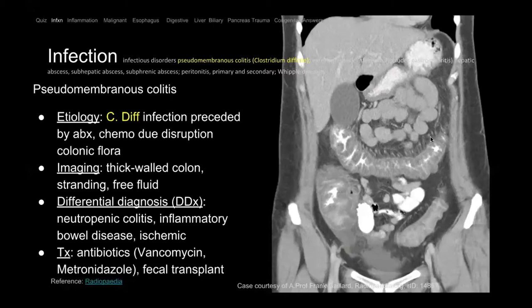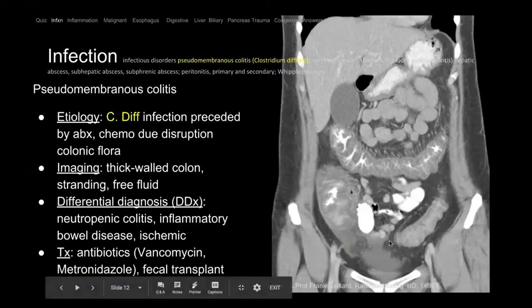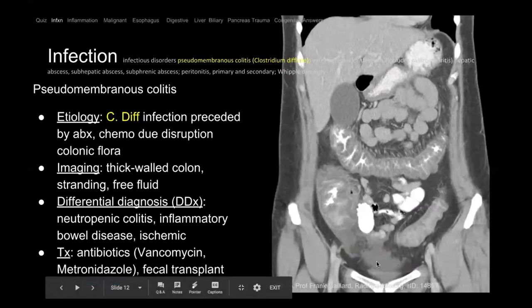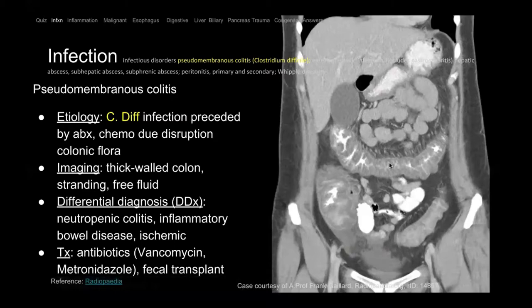This is the transverse colon. There are three mesocolons — the transverse mesocolon, a small bowel mesocolon, and a sigmoid. These little linear vessels are engorged vasa recta. The bowel is thick-walled and there's free fluid, so there are inflammatory changes. This is pancolitis — the entire colon is inflamed. Depending on the clinical context, it could be from different causes.